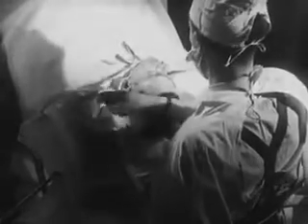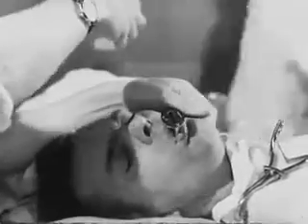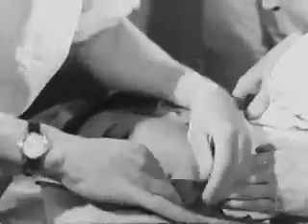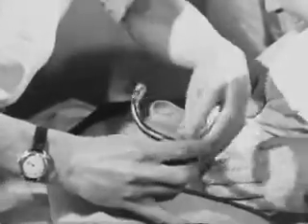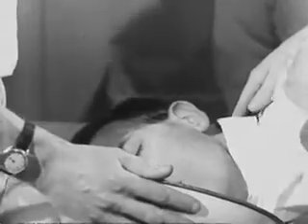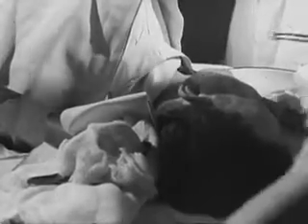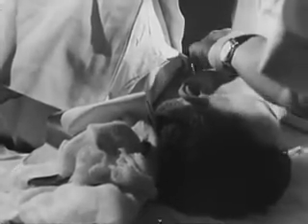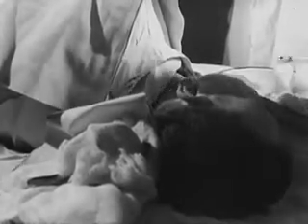But here, as so often, anesthesia has lightened so much that the patient cannot tolerate it, and it makes him vomit. He must be turned on his side at once, and his throat cleared. Vomiting is a disaster that may cost him his life, either at the time from laryngeal obstruction or later on from pneumonia due to inspired vomit.